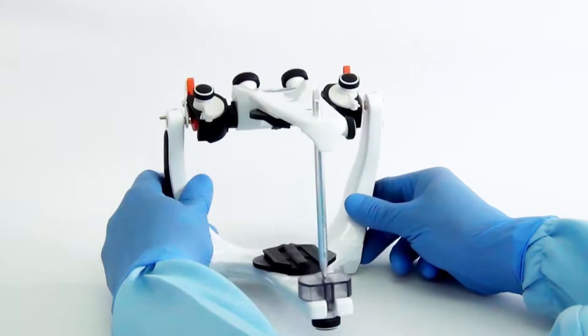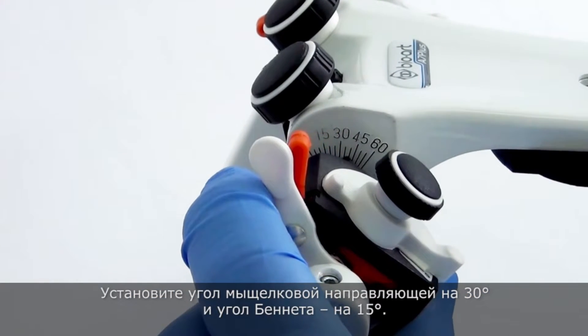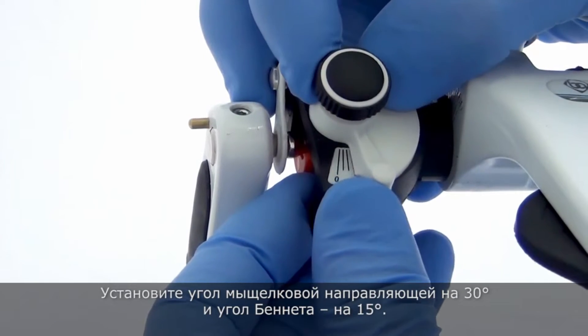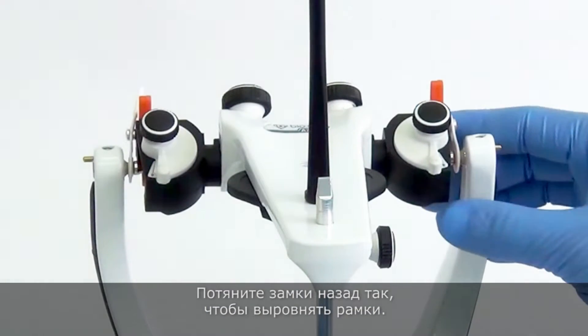Preparation of the A7 Plus Articulator. Adjust the angle of the condylar guides at 30 degrees and the Bennett at 15. Push the locks back so that the frames are aligned.